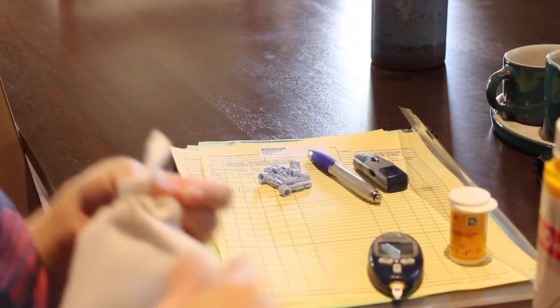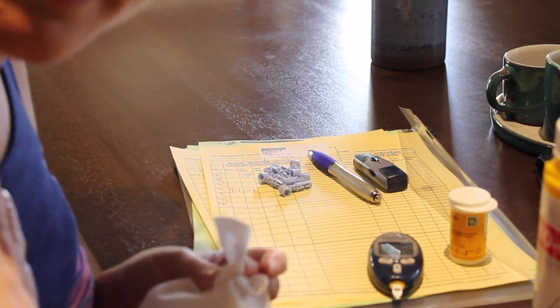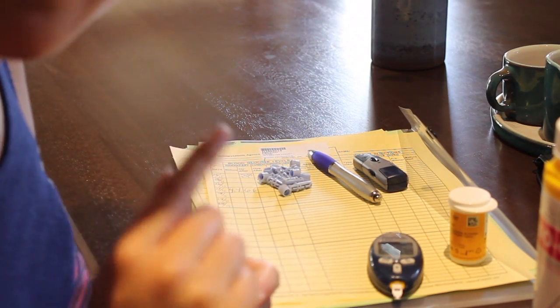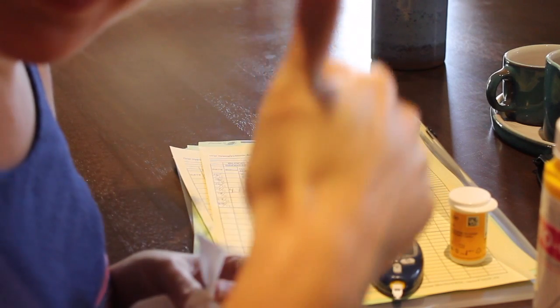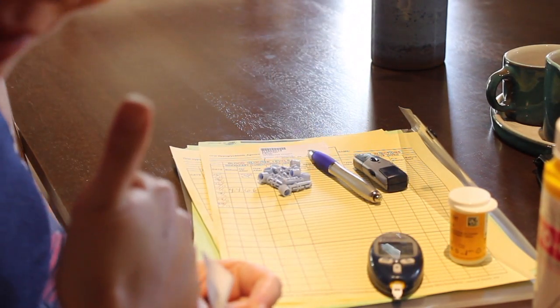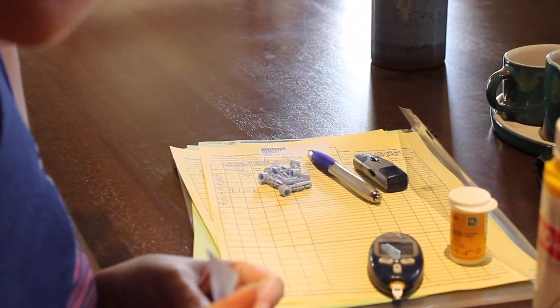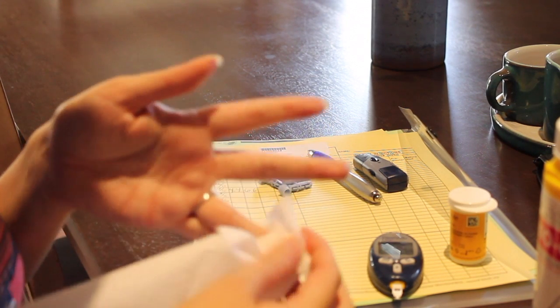So, one hour after a meal, what you want, as someone with gestational diabetes, is to be below 7.4. Now that is well below, not too low though. So it's very comfortable. So we've got to give a thumbs up for my lunch choice today and the way my pancreas is managing the glucose and the insulin here. So very happy with these results.